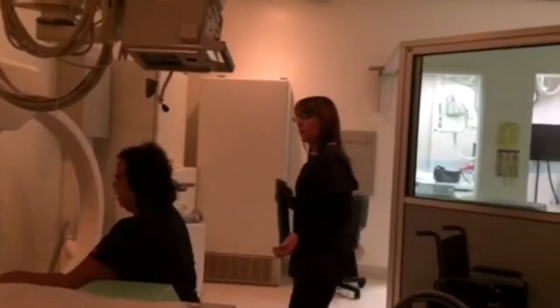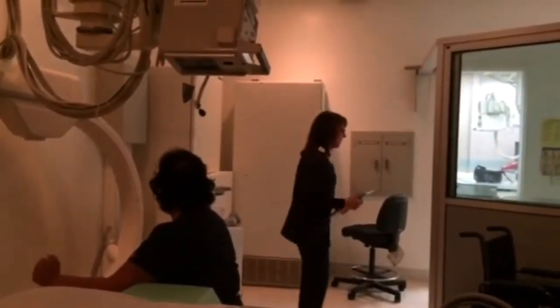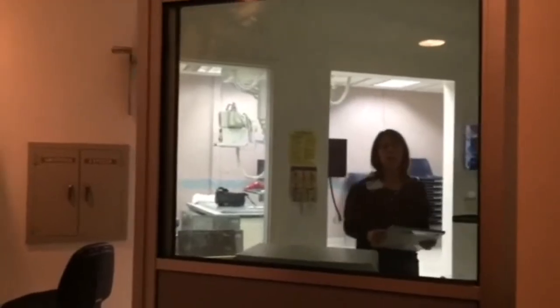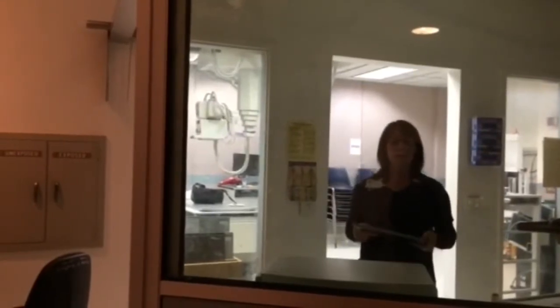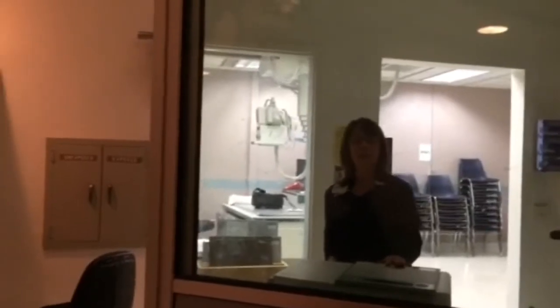I'm going to take a look at the views to see how they came up, and then I'll be right back. So just relax. Okay. So I'll take all of my cassettes. I'm going to scan them in the reader one at a time. Take a peek at my images to see if they are acceptable. Drop the reader. Okay, that looks good. And then I will critique my images on the evaluation.